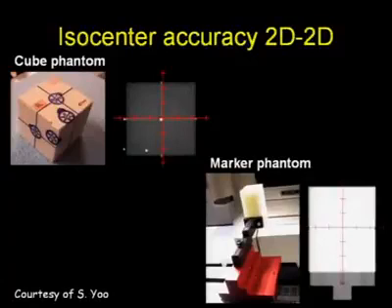So the principle behind this method is to place a phantom, align it with the room lasers, and then test it out using the software. So any phantom can do. Again, a ball bearing on top of a styrofoam cup will do. Varian provides a number of phantoms. There's a cube phantom here that can be used with some ball bearings on top in order to give it some orientation information. There's a marker phantom or anything that will do, and it can be compared again with a reference CT data set so that one can assess how the daily images compare with baseline data sets.